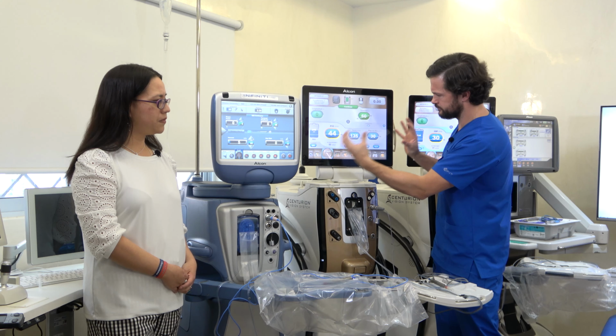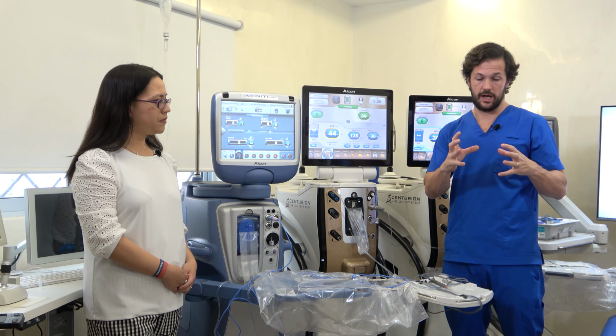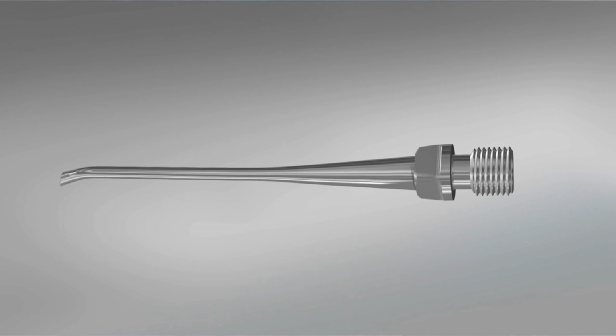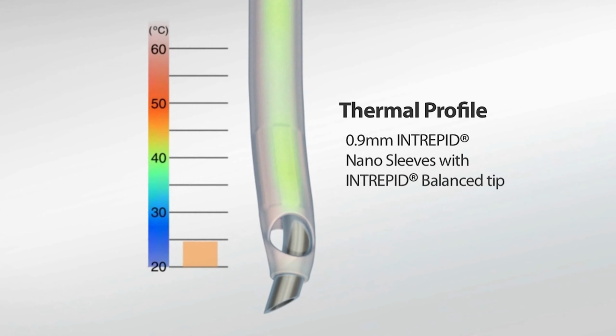And fluidics is going to make a stable anterior chamber at all times, and also remember that ultrasound will generate heat and energy, so fluidics can make that more stable. Right. So yeah, I agree with you.